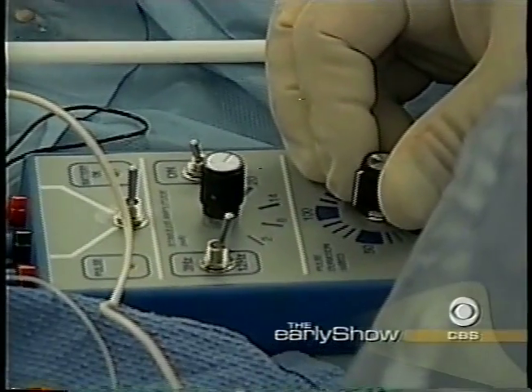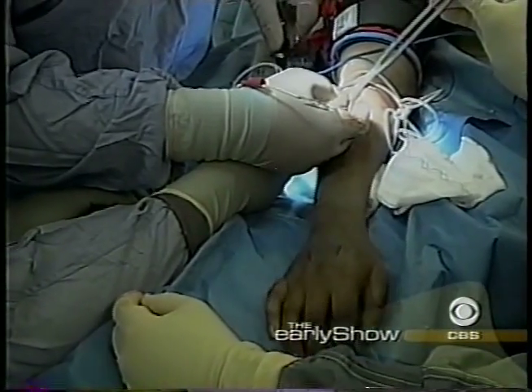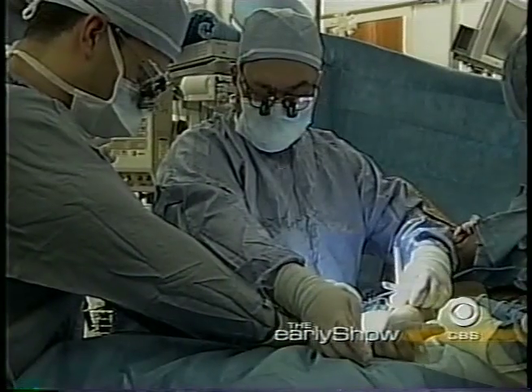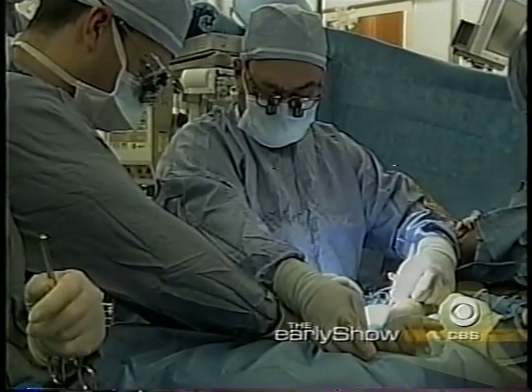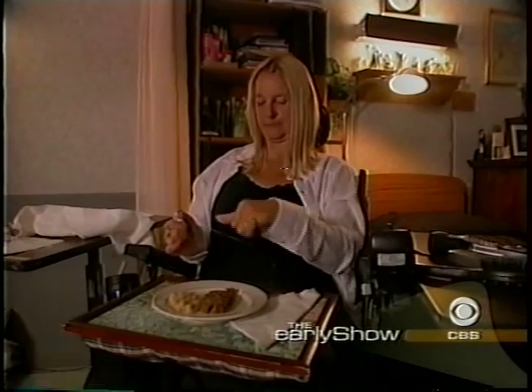Electrodes are implanted in the body, so that when the implant is turned on, it electrically stimulates the nerves in order to cause the muscles to move in motions, for example, to open and close the hands. That's under the voluntary control of the patient. I had these 2 implanted electrodes here, and I do a little twitch with my muscle in here, and that turns it on or off. I've always compared it to being like a toddler learning how to walk, write, eat.